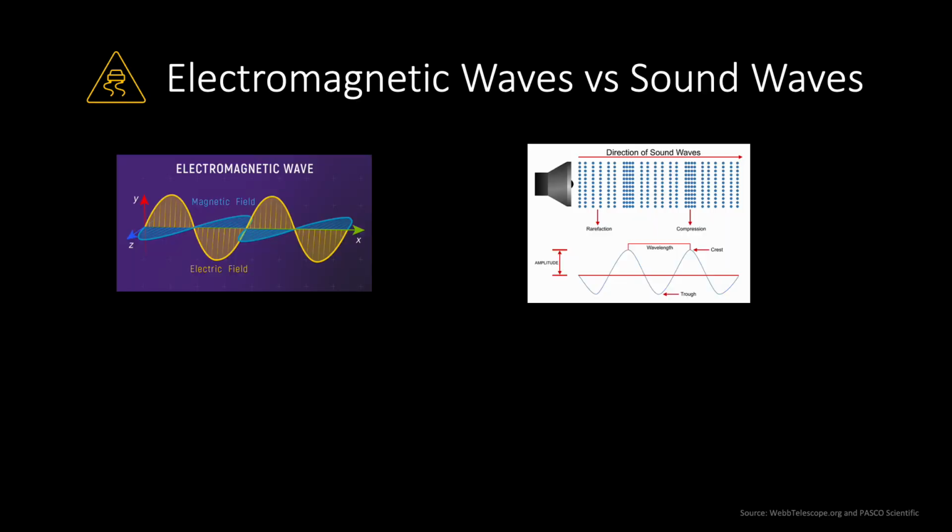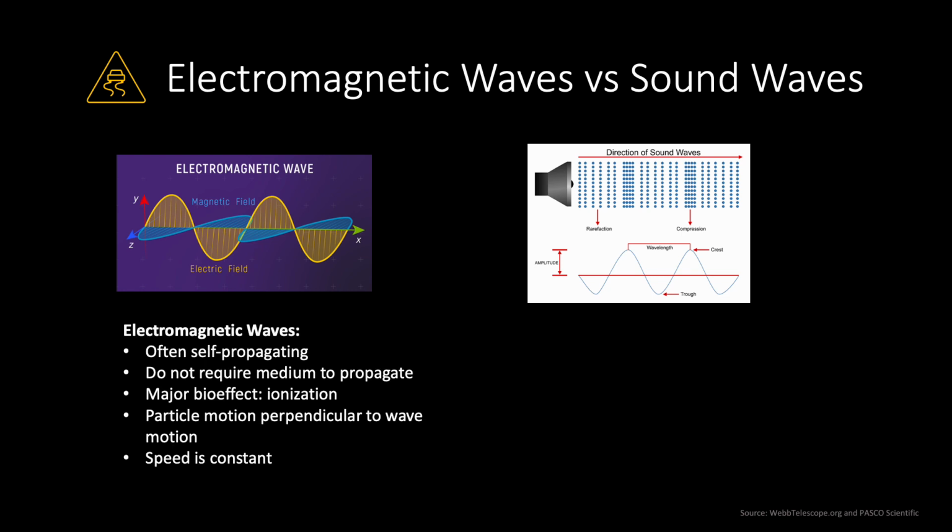Now, it is important that we pause briefly just to discuss the differences between electromagnetic radiation, which you may know about, and longitudinal or sound waves, and the properties that separate them or make them different. Although we'll talk a lot about waves, most of us think of waves in the way we think about X-rays or light waves. And there's a lot of similarities, but there are a few key differences. So let's start with the electromagnetic waves.